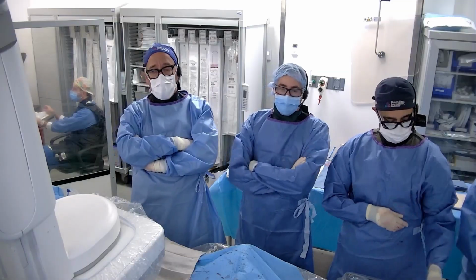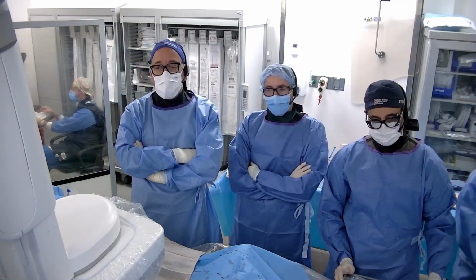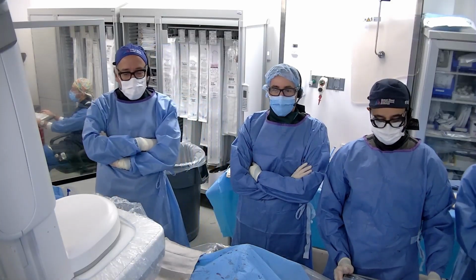Nice and very economical crossing there, Rob. That was that CTO. Just to be clear, Rahul did the crossing. I didn't. He makes it look easy.